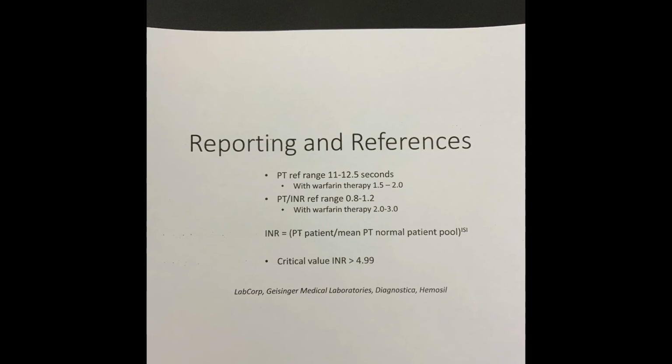As far as references go for this talk, I use LabCorp and Geisinger Medical Laboratories for a lot of the specimen handling information, and Diagnostica, the company, for information on the analyzer and hemostasis protocols and some of the elements of valid reporting, and of course the manufacturer inserts for considerations on how to make reagents and find that ISI value.